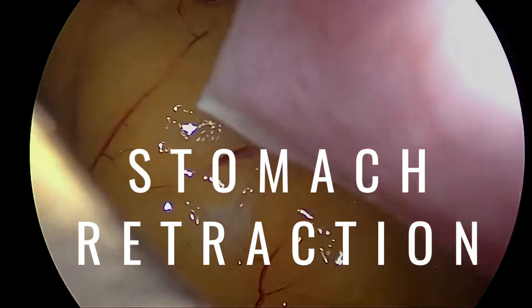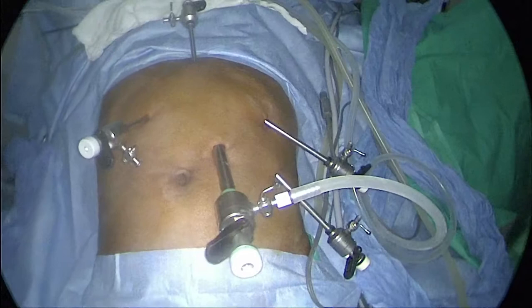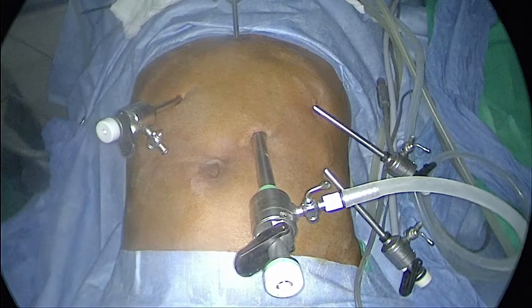The last is the stomach retraction port. It is 4 cm below the left subcostal port. You can see all the 5 ports, they're all directed towards the hiatus.